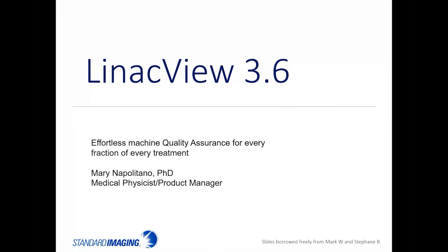My name is Mary Napolitano, and I'm going to be speaking to you this morning about LinacView, which is an effortless machine quality assurance for every fraction of every treatment.